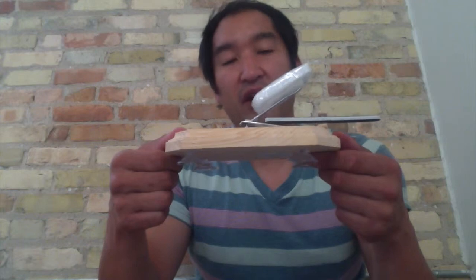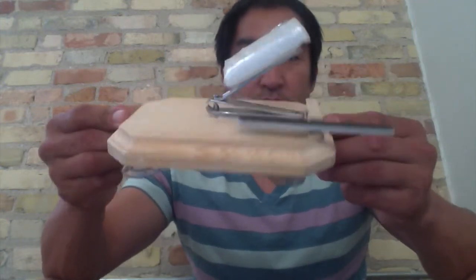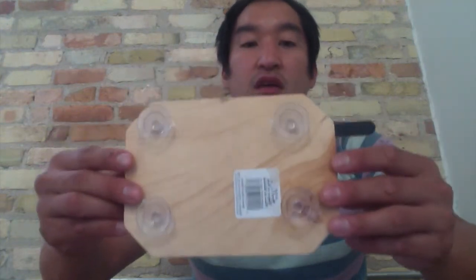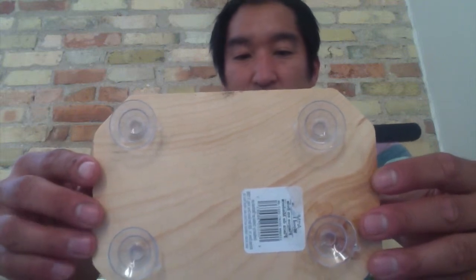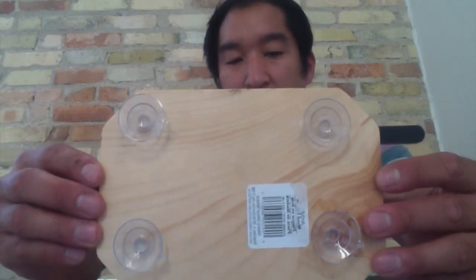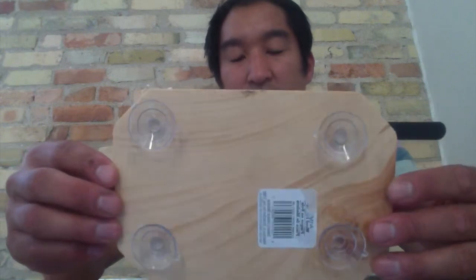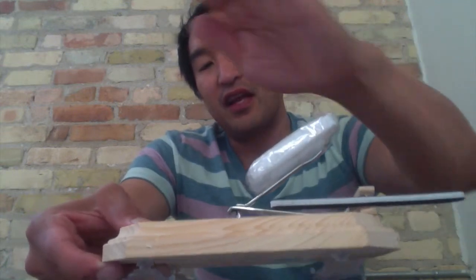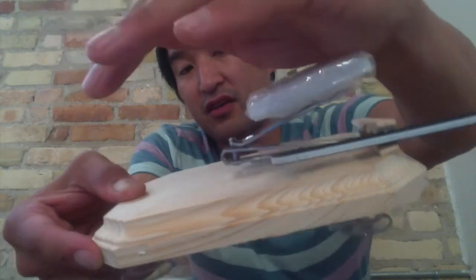Hello everyone, I'm going to provide a brief overview of the features of the adaptive nail clipper. Quick overview of the device. Starting at the bottom, there are 4 suction cups. These help provide support. You can just attach it to the table. It's really helpful for an individual with limited fine motor strength. As you turn it around, there's a pad here so they could actually use their palm instead of their fingers to cut their fingernails.